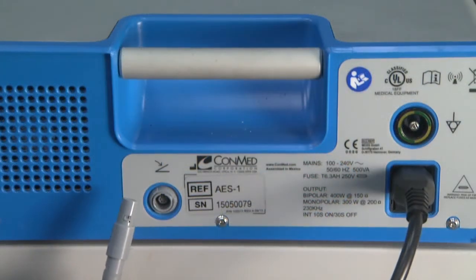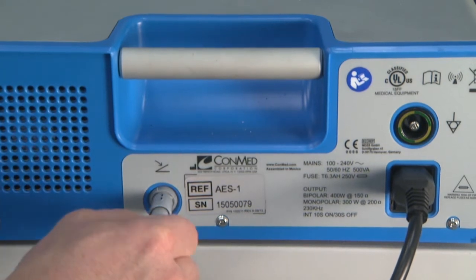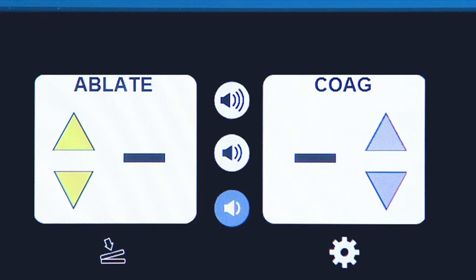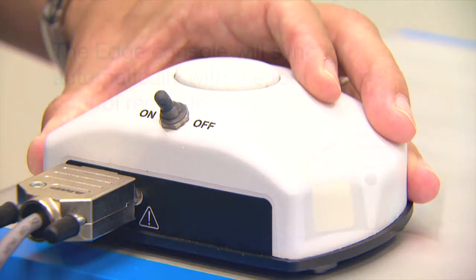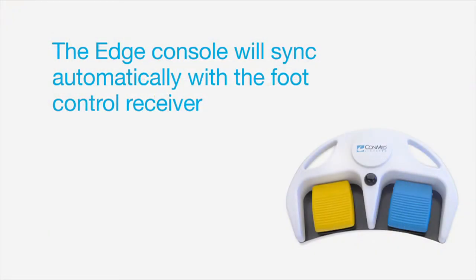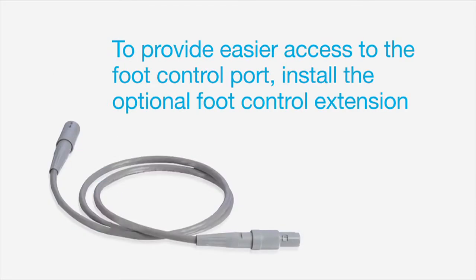For wireless foot control use, first insert the receiver's connector into the port on the back of the Edge console — a foot control symbol will appear. Then turn on the receiver by using the switch on the top of the foot controller and receiver. The Edge console will sync automatically with the foot control receiver, and an audible tone will sound when pairing is successful for the first time. To provide easier access to the foot control port, install the optional foot control extension to bring the connector to the front of the generator.